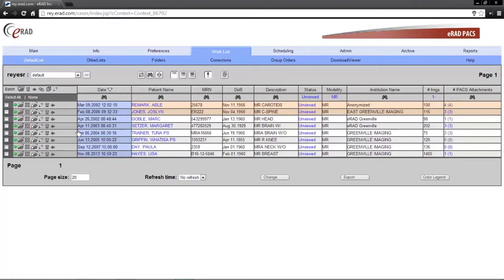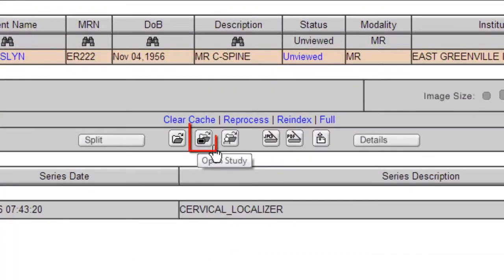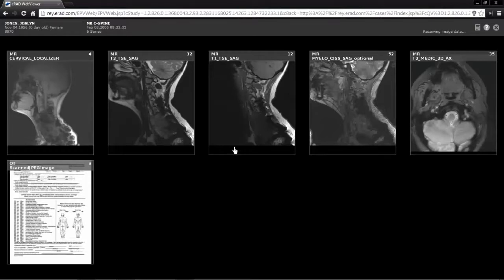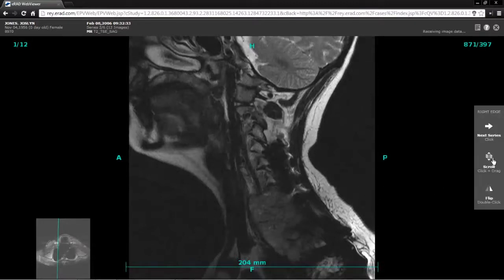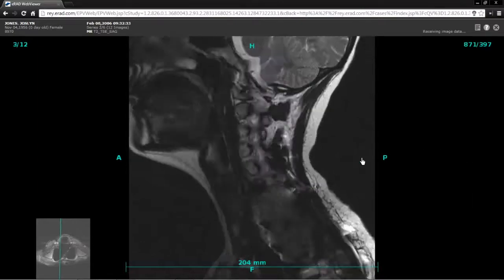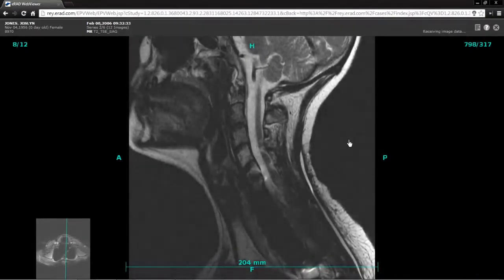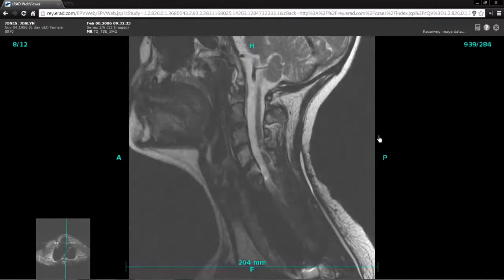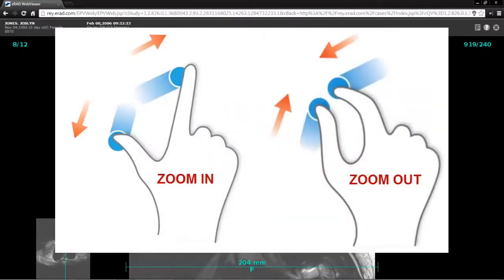For demonstration purposes, I will use the quick view page. This is the web viewer icon. Basic tools are available to manipulate images. This includes scrolling by using the mouse wheel or placing your finger in this area of your mobile device and moving up and down. Window level by holding the right click mouse button and moving the mouse up and down, left and right, or moving your finger over the image on a mobile device. Magnification by pressing and holding the right and left mouse buttons and moving the mouse up and down, or using your fingers in a pinch-to-zoom manner.